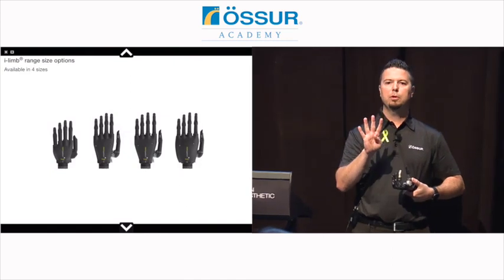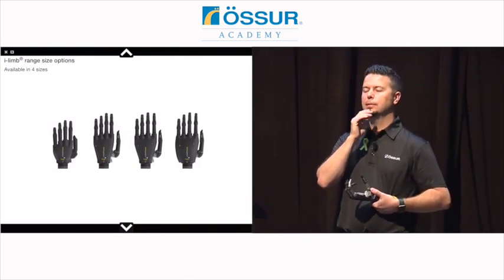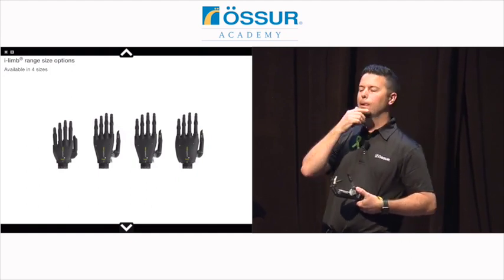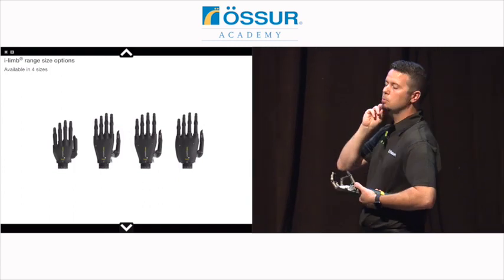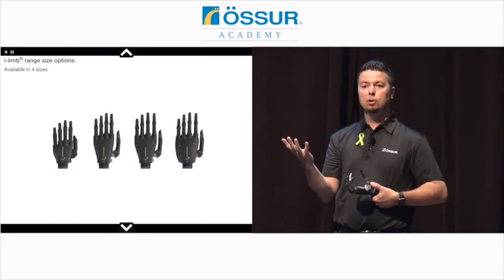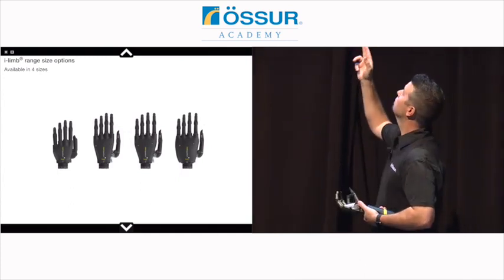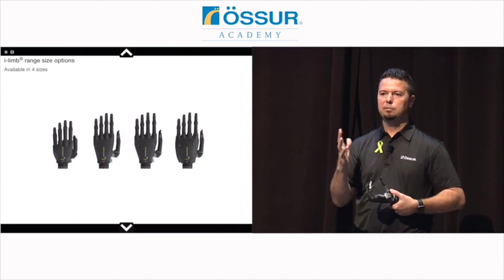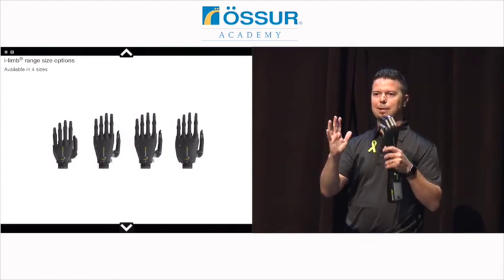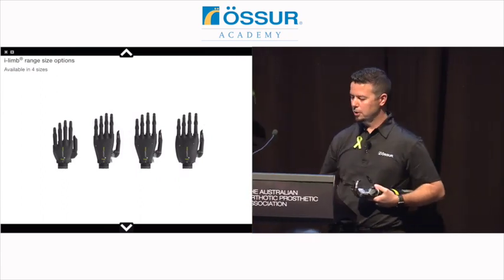The hand's available in 4 different sizes. Tall, venti, grande. No, that's wrong. Sorry. Extra small, small, medium, and large. We sell mostly smalls and extra smalls in the States. I would imagine that'd be the same here. If you've got somebody that has a larger hand, maybe a bear paw for a hand, that is where that large is helpful. I have a guy that I work with that has a hand that he could palm a basketball. That's the kind of hand we're talking about. It would be more appropriate to have a large hand there.